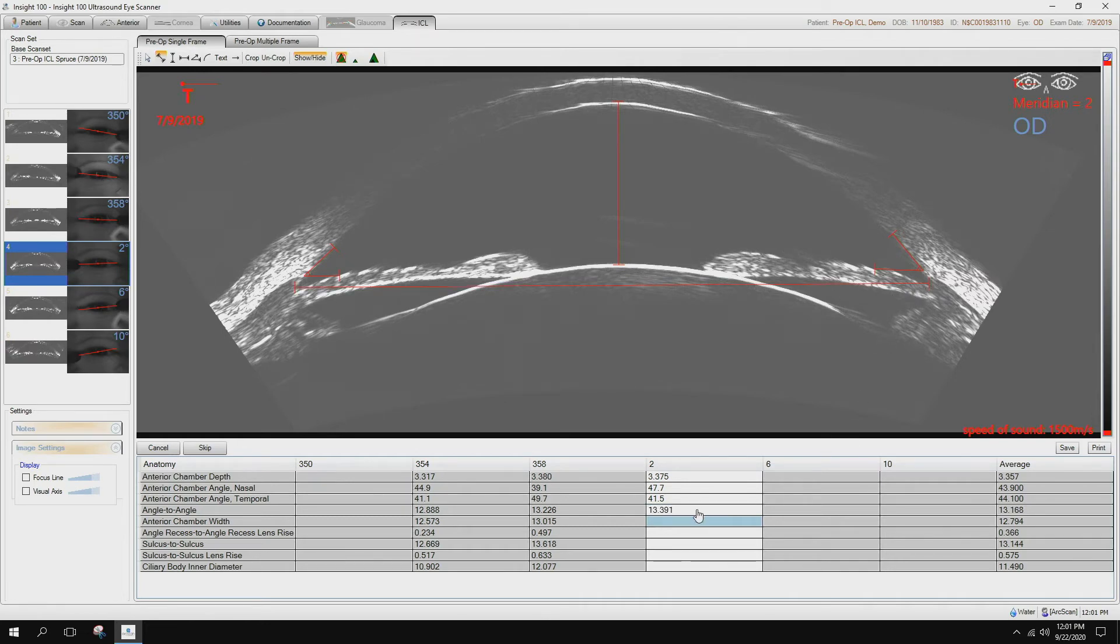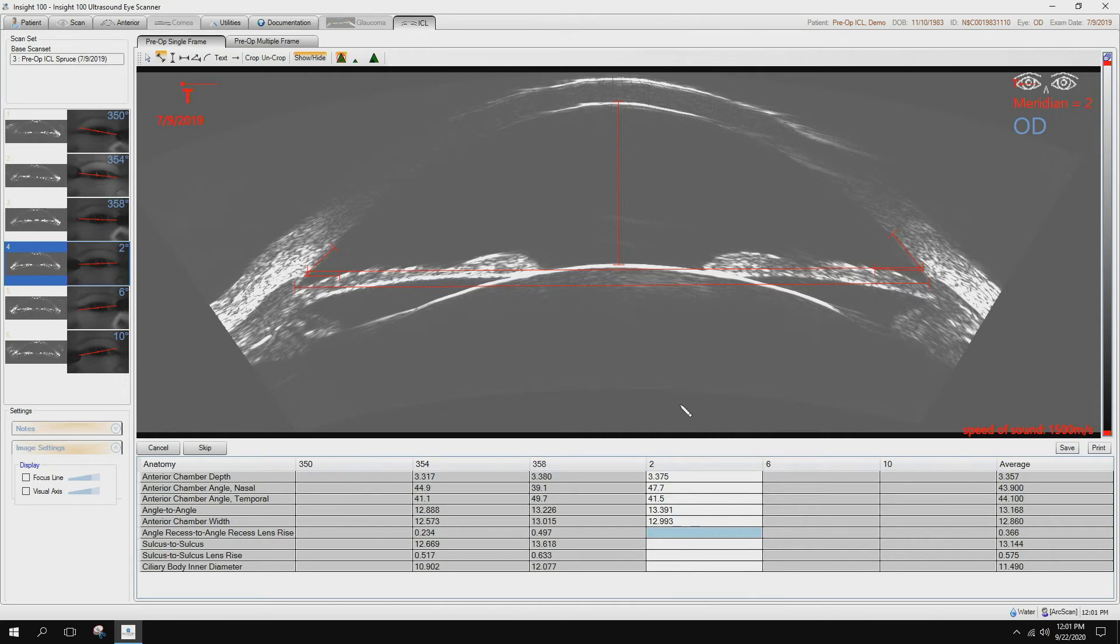So here are our angle chamber width. Now angle recess to angle recess, lens rise.